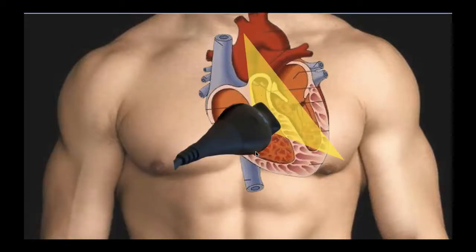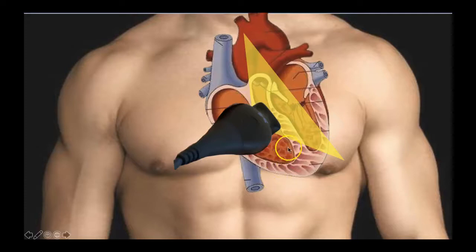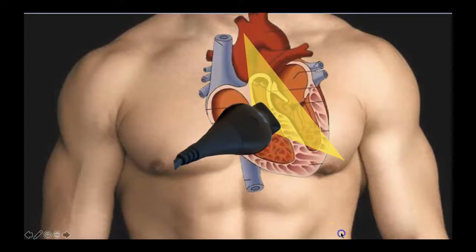Let's start off with our parasternal long axis view. You're going to have your probe to the left of the sternum — the patient's left — with the probe marker towards the patient's left hip. Just as an FYI, some different departments, such as some cardiology departments and ICUs, will flip this convention and have the probe marker towards the patient's right shoulder. But for us today, we're going to have the probe marker facing towards the patient's left hip.